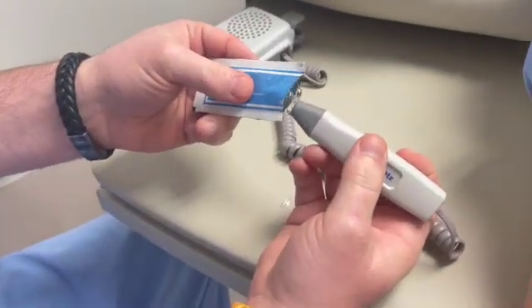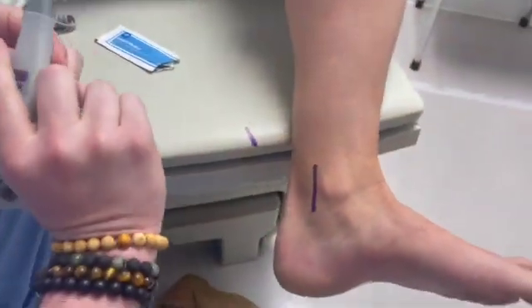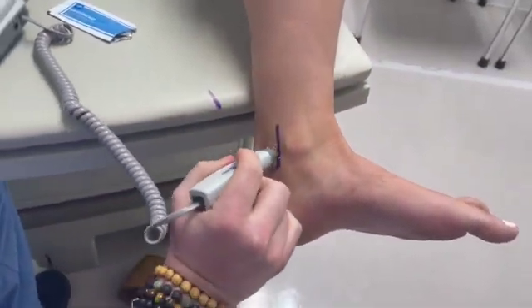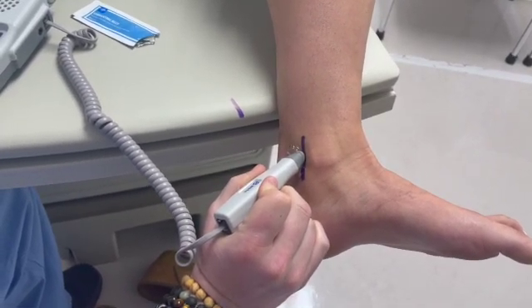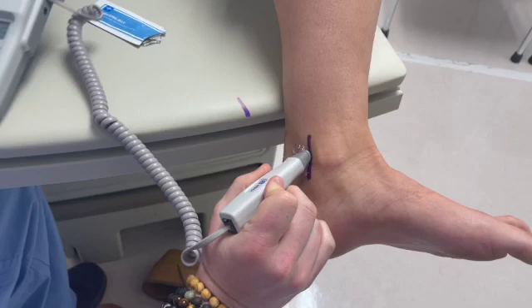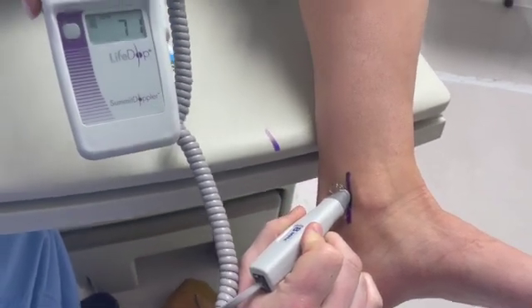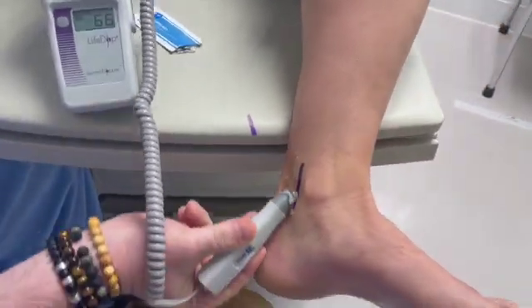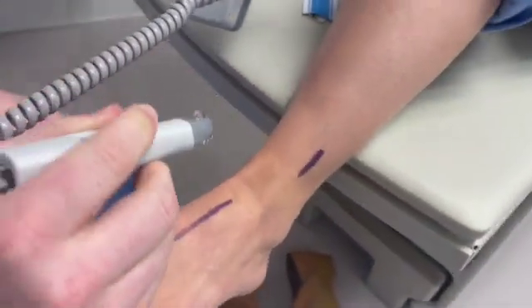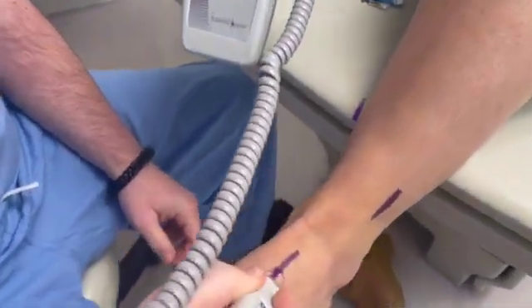First, you want to put the gel either on the patient's skin or directly on the probe, then bring the probe over to listen to the pulses. You can hear a nice triphasic doppler signal for this healthy patient's posterior tibial artery.